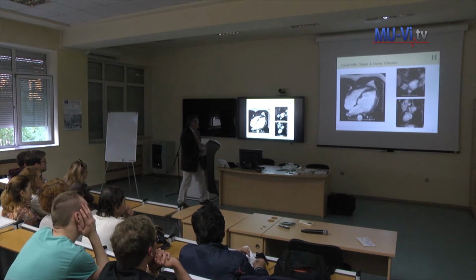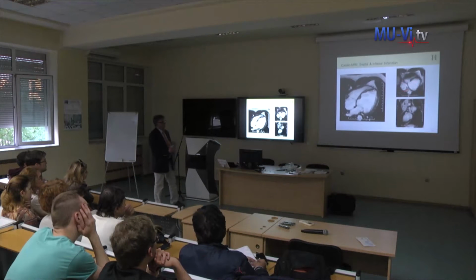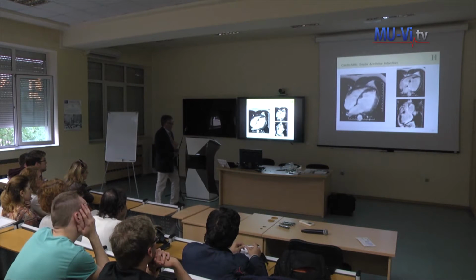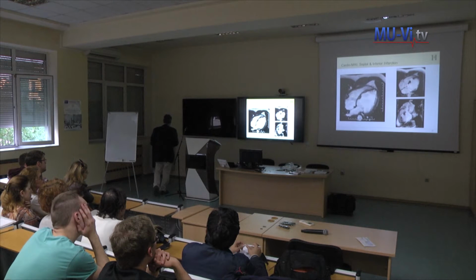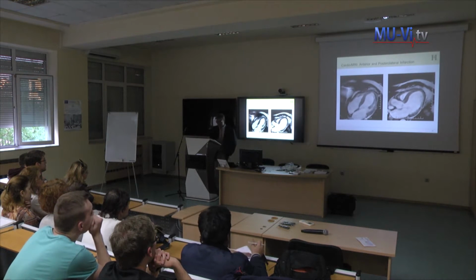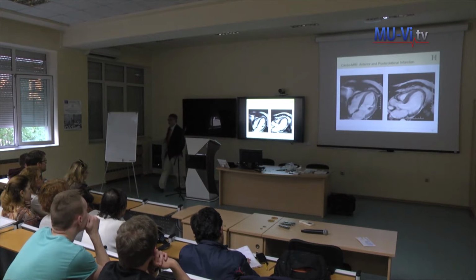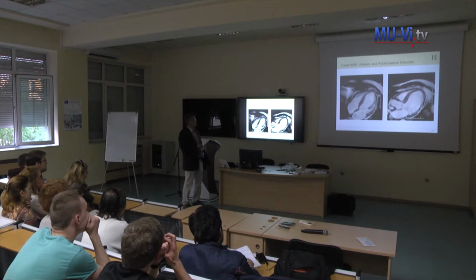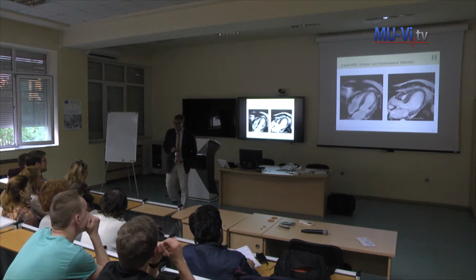And in late enhancement, we see these scars here. The white thing is the septum, and inferior, you see it here, it's the white thing here at the inferior wall. So this was a patient with an inferior and a septal heart attack. He survived that, but he died on the road to Switzerland 2 years ago in a restaurant, on the toilet in the restaurant.